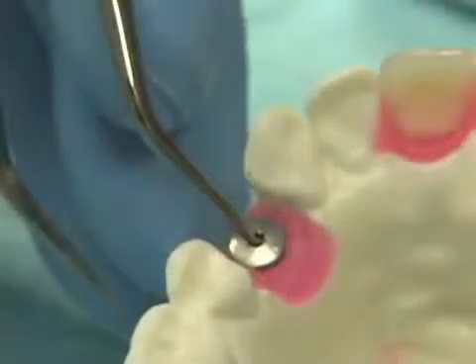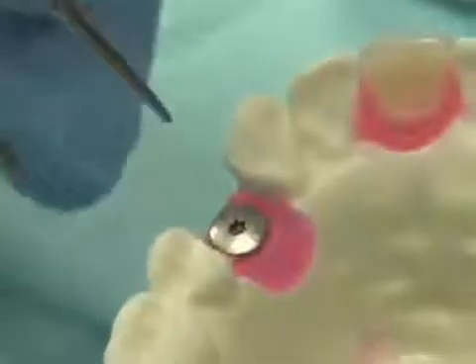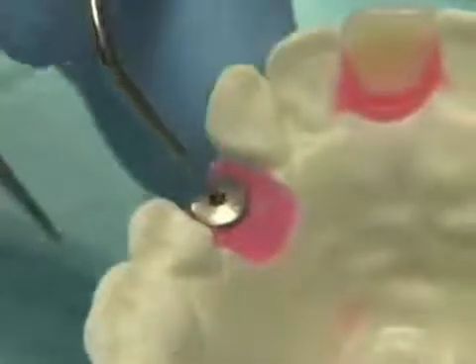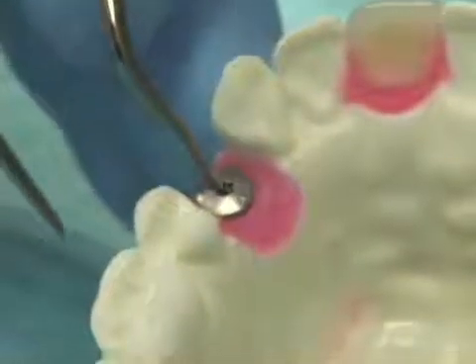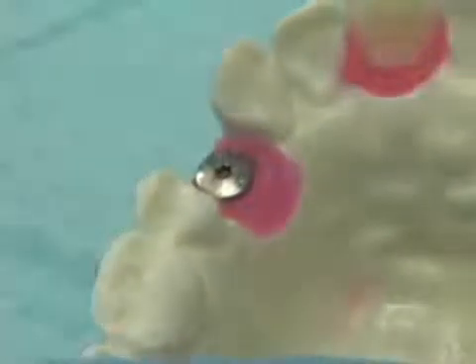And so this wrench fits very securely into the little healing screw. Now many times when patients come back for their 3-month visit, there will be little bits of food debris that plug up this little recess. So what one wants to do is take an explorer and go in here to make sure any food debris is cleaned out, and then rinse it with an air water syringe.